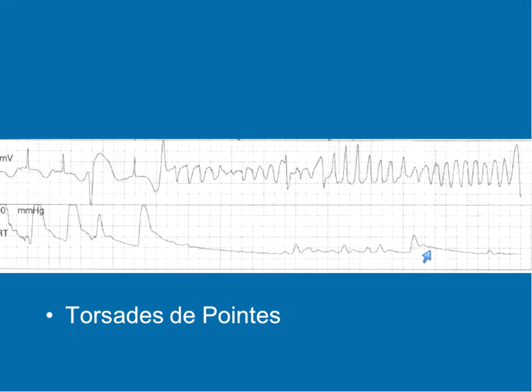Now, the other thing that torsades de pointes means, I think it's a French word, but it's kind of a twisting. So what you see in torsades is you see this sort of a shape, even top and bottom, although this is not as pronounced as some, but you kind of see this up and down, kind of a rotating movement.